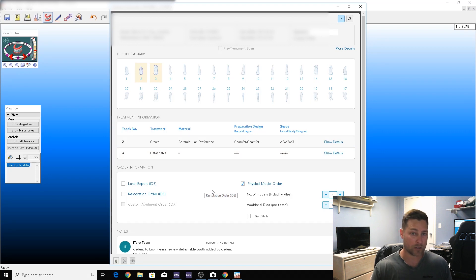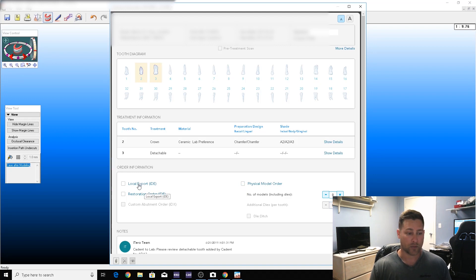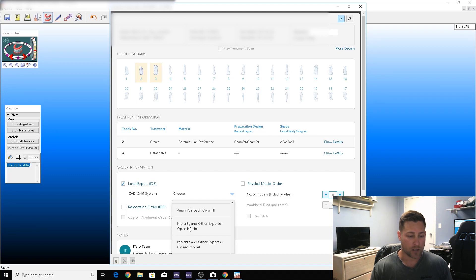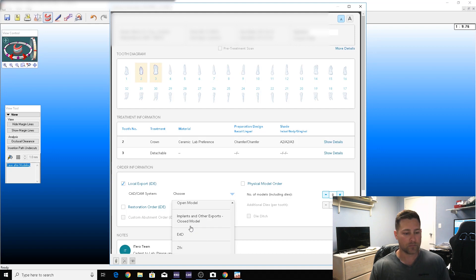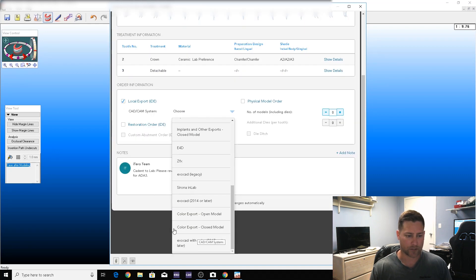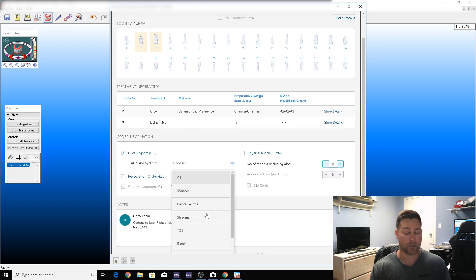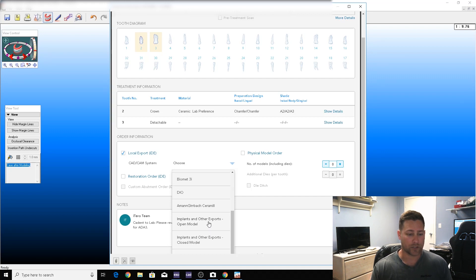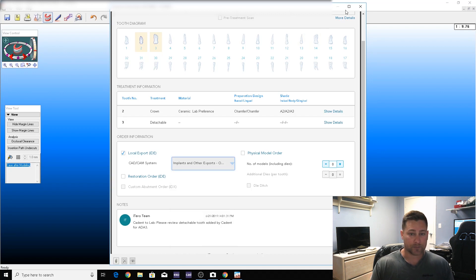This is very important: if you do not want iTero to print the model for you, you need to uncheck that option and create your own model. Come over here to Local Export. If you want to mark the margins yourself in ExoCAD, you must choose this option — Implants and Other Exports > Open Model. If you want to use iTero's margin, you can choose the Color Export option down here. Don't waste your time on color export — it doesn't do a great job. The pink tissue gets blended in with the tooth color and it doesn't help when trying to mark the margin. I always mark the margin myself.